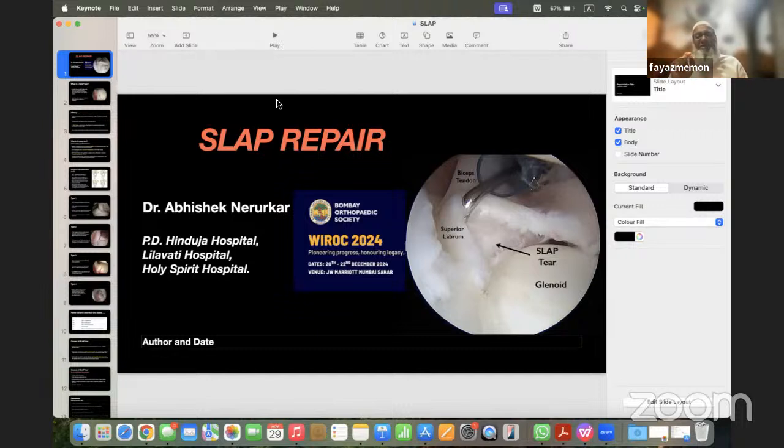The only small trick that I am trying, which we missed in the last discussion, is that when you're tying the knot, I always use an antegrade suture passing device from the anterior portal and take the most inferior bite. So that, as Sajid said, once you have that anchor placed and that capsular shift proper, then the majority of your work is done, irrespective of the last anchors. What happens is that when you're tying the knot, I always use this knot to be tied rather than, just hold on.